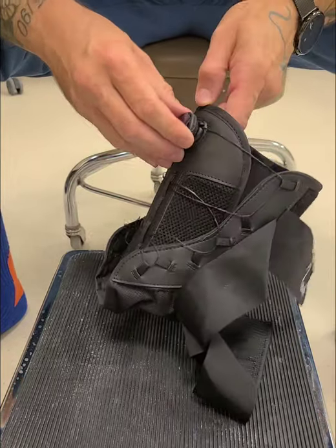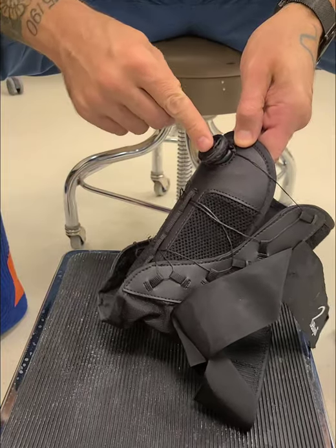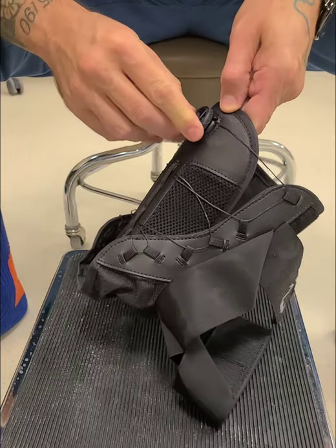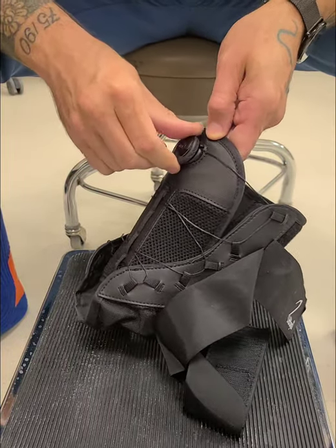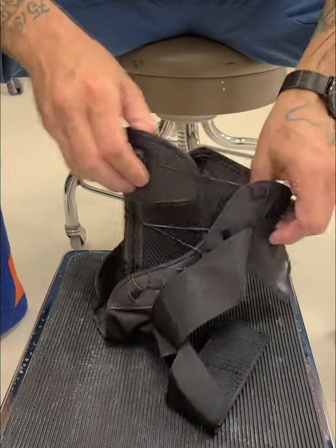So what we do is this BOA dial — when it's loose it just spins freely and all the laces are loose. To make it tight you push it in, it clicks and then makes that clickety sound as it tightens. And then when you go to take it off, pull it out. So we'll get it loose.